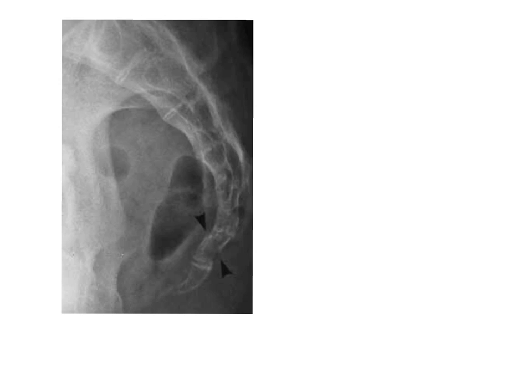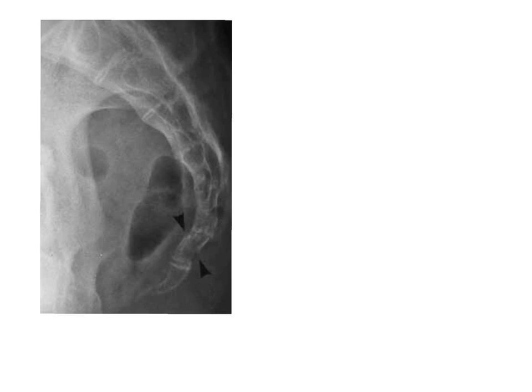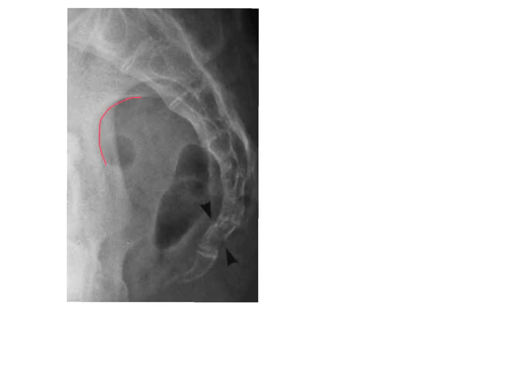Other anatomical structures that you would need to pay close attention to are these guys over here. They run this way, and here's the other one running this way. These are the greater sciatic notches, and these, if lined up, give us an indication that we have rotated the patient just perfectly so. Too much discrepancy between these or separation between these indicates too much rotation, therefore we would need to repeat the image. We are going to have a little bit of overlap due to magnification and OID, but this would be acceptable.